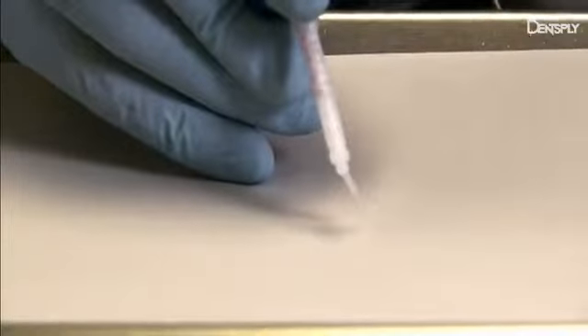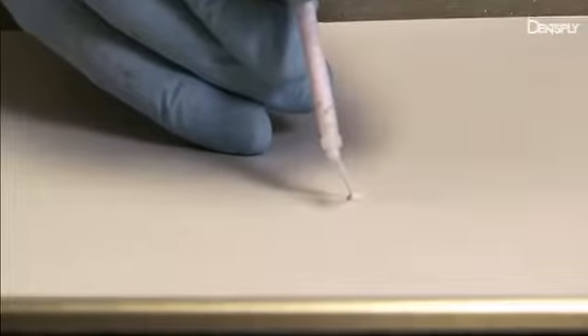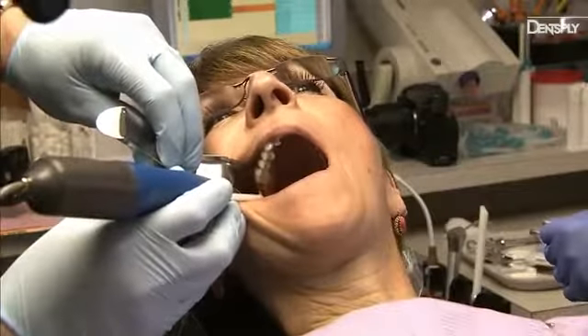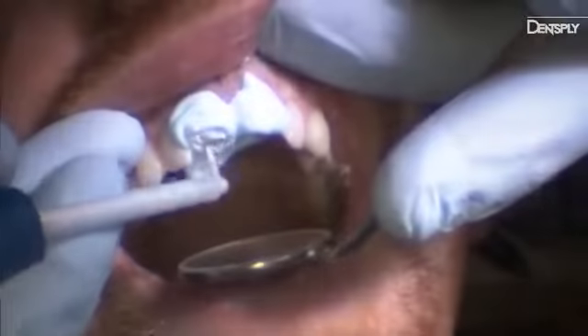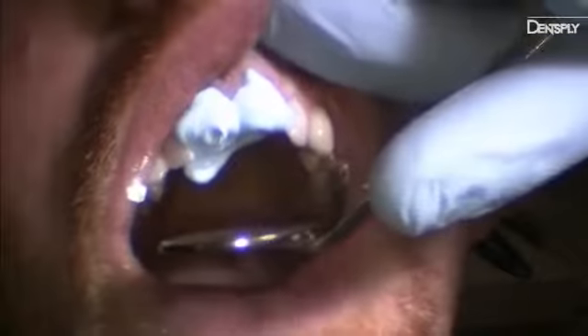Press the foot pedal to dispense a small amount of Aquasil Ultimate wash material to assure accurate mix. Immediately insert the intrasulcular tip into the sulcus. Press the foot pedal to begin dispensing the Aquasil Ultimate Tissue Managing Impression material into the sulcus. For best results, flood the sulcus and go around the tooth twice. Cover the entire prep if desired. Each single unit or multi-unit cartridge comes with precisely measured amounts of wash material.